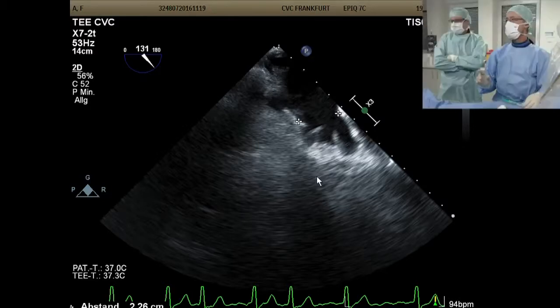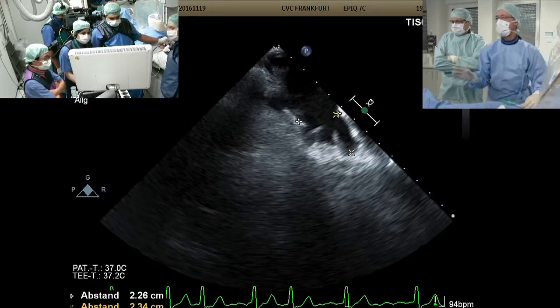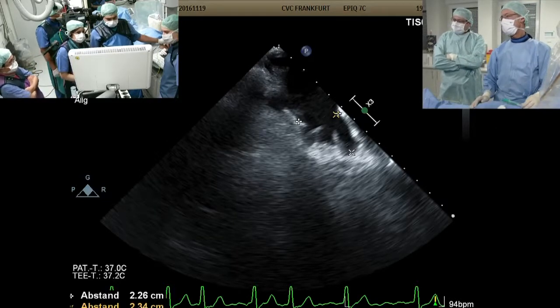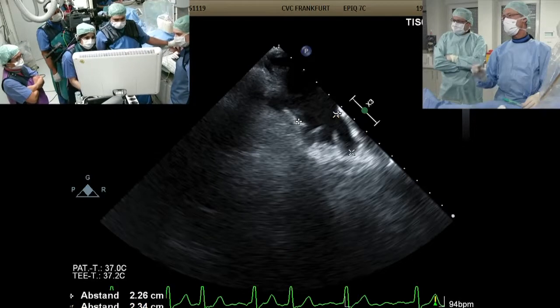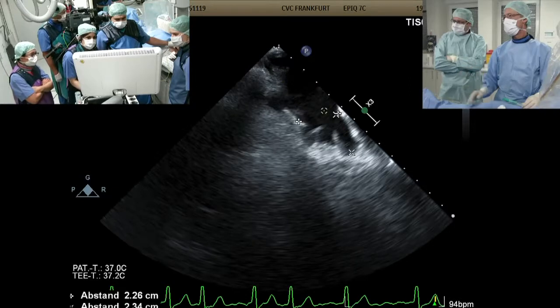So the length of the functional landing zone, can you just point it with your arrow, what that means? That means from this plane towards the ridge, the distance. And so that distance is 20... That's the diameter of the landing zone, and now the length of the landing zone. Okay. Peter? I think in this case do you mean the whole lobe, Horst? This would be if we are able to put the device into that particular lobe. So now it's 23 millimeters. Yeah, but measuring to the ridge, which is the functional landing zone. Okay. So that is almost 0, isn't it?